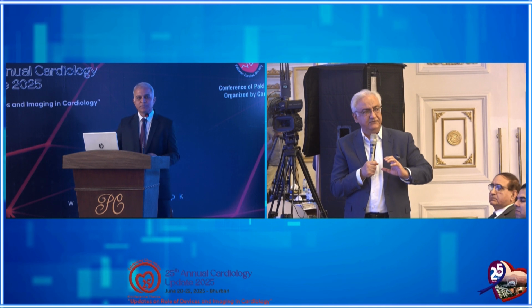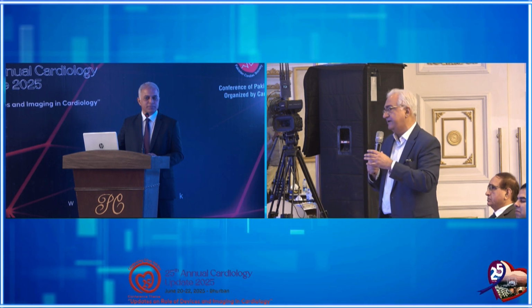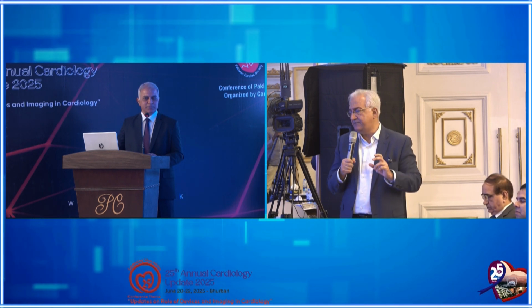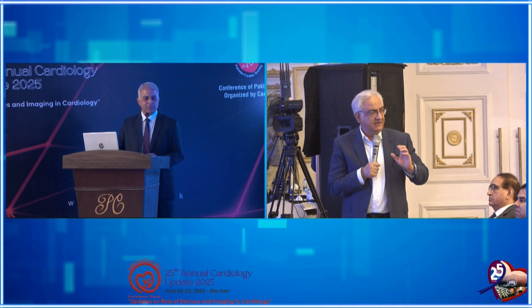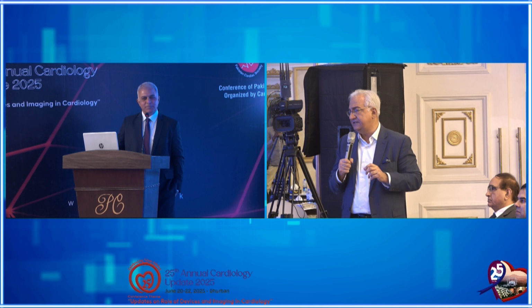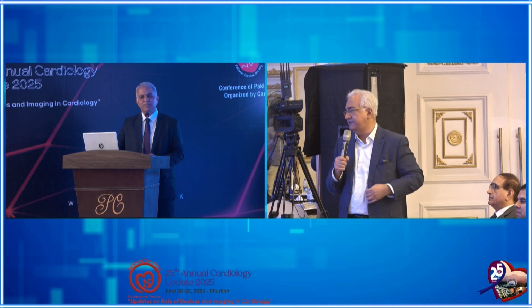So it's very important that you keep this backup plan always ready in the back of your mind, and must work out in your mind what the strategy is. And right up front, you must decide whether it's going to be 2 stent or 1 stent. You might have to use 2 stents for a bailout. But if it's a significant side branch with a long lesion, one must go with a 2 stent strategy. And in those bifurcations with a significant lesion in both branches, there's enough data to suggest that it is much better than provisional. And one must be ready for a 2 stent strategy where there's a significant and critical lesion in the side branch.